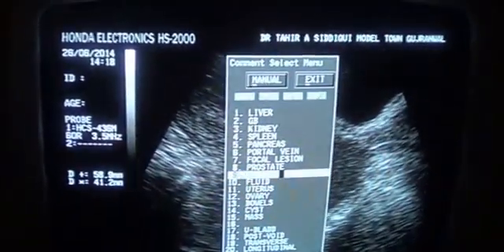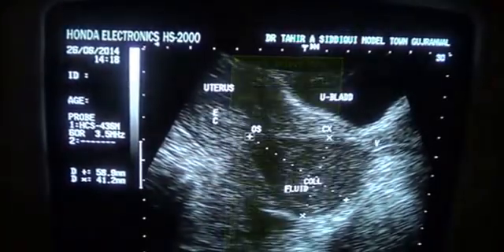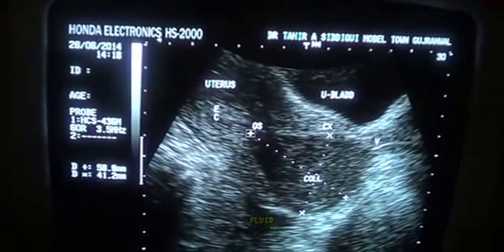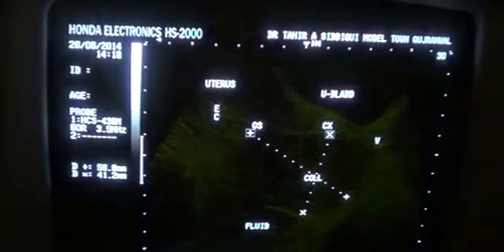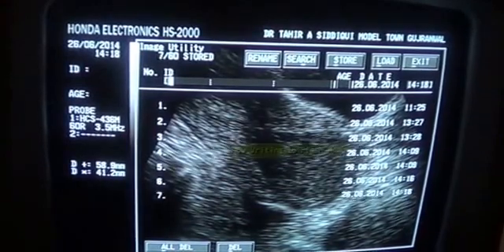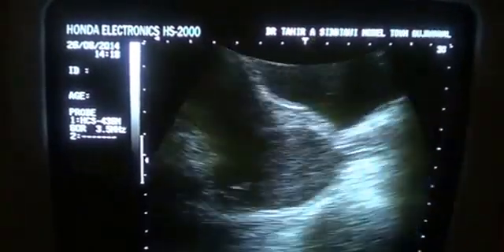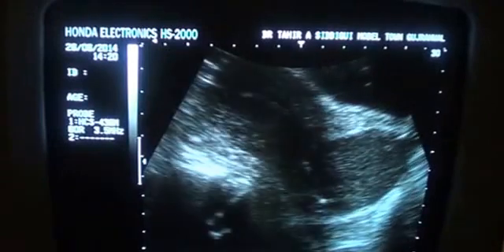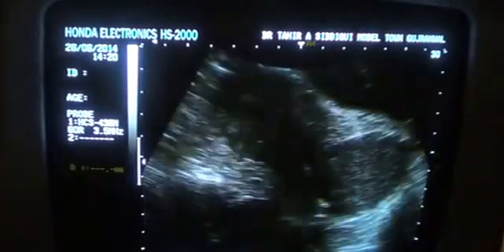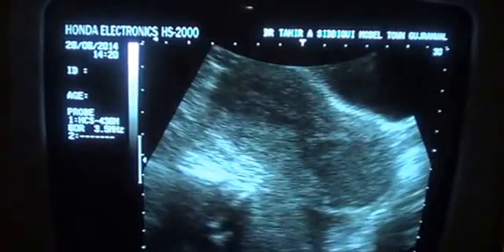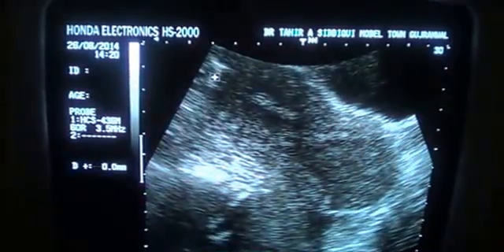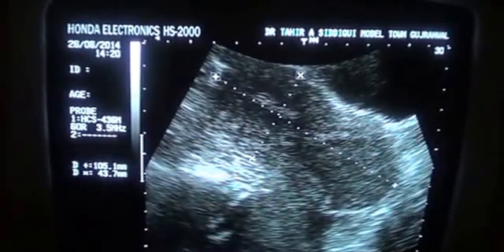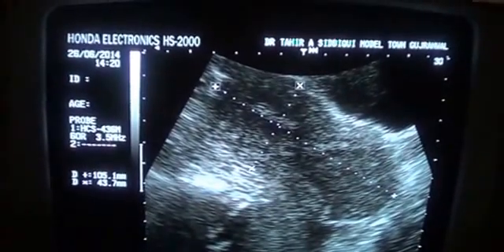This is a rare thing to see in a married parous female, but as I saw it, I grabbed the opportunity to make a video for you. This is the small amount of fluid seen in this region, and this is the magnified view of the collection. In the collection we do see some tiny shiny echogenic areas. The whole length of the uterus including the collection measures 10.5 by 4.3 cm and will be considered as within normal limits. Thank you very much.